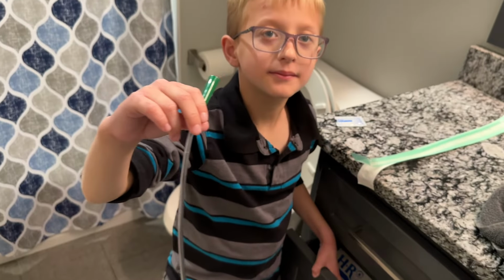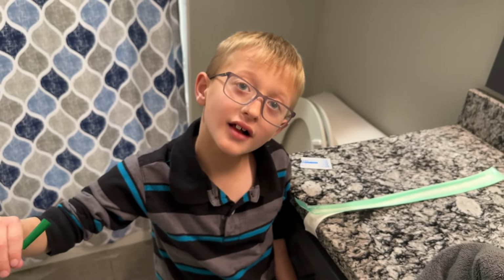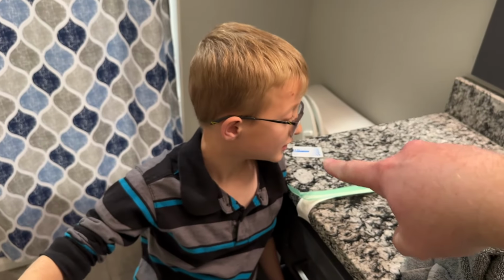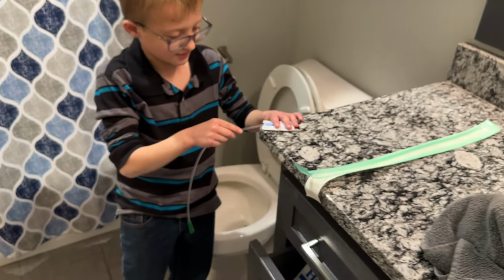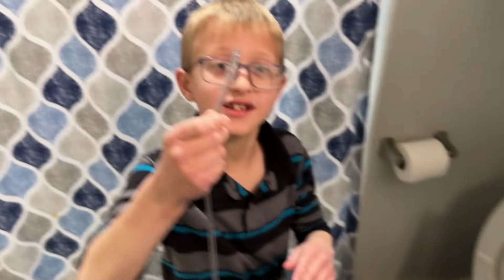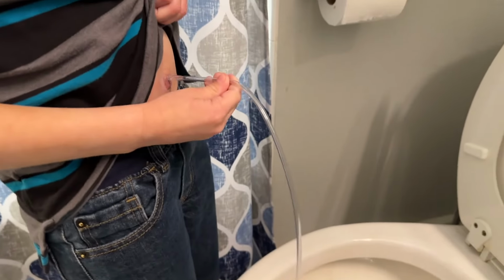Okay, and since the stoma is made out of appendix, we want it to be nice and smooth when we pass the catheter through there into his bladder. So we use some silicone jelly, some lubricating jelly. Go ahead and dip it in there. We just dip the tip in. Don't have to use a whole lot. Just like that, yep. Maybe the first inch or so. And then he just sticks it right in there.